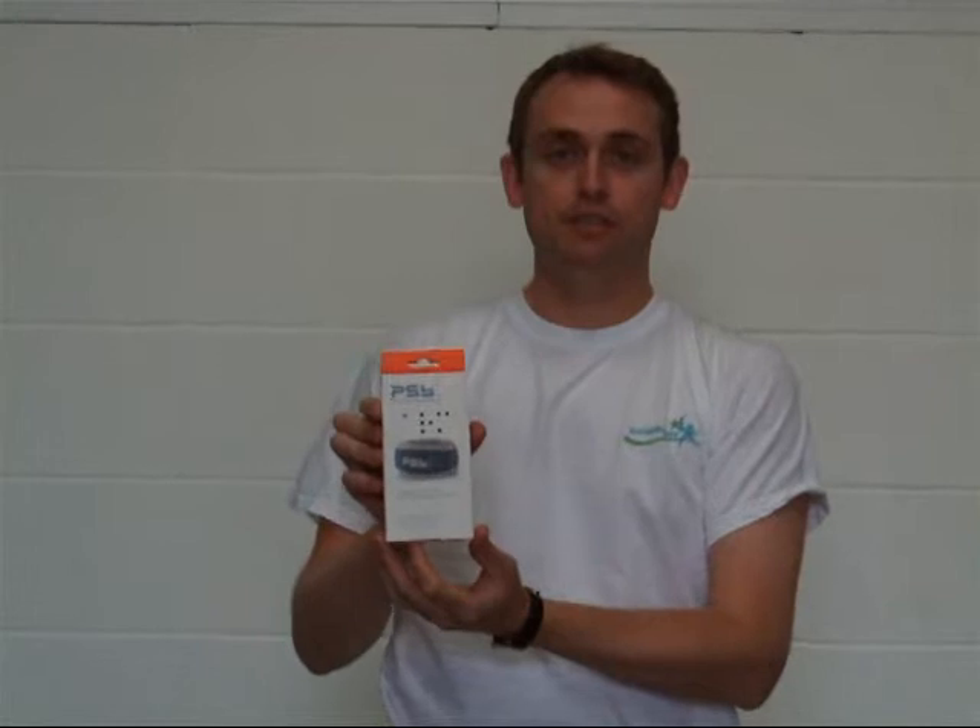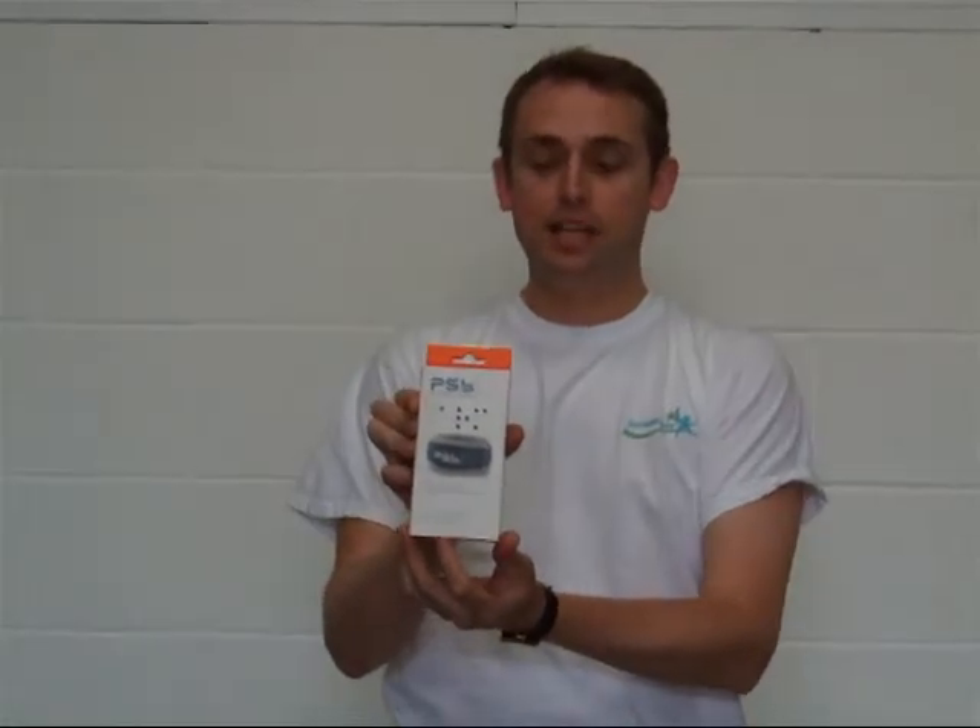I'm Michael Davison, Managing Director of First Aid for Sport, and this is the PSB arm brace used for tennis elbow.